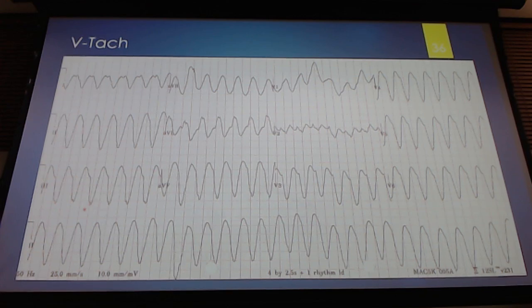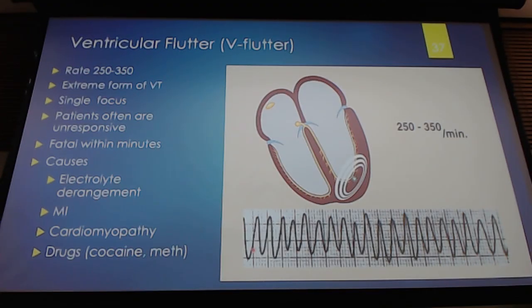But we're going to notice this wide complex tachycardia and say, okay, you're in VTAC, let's go ahead and do something about this VTAC. Let's slow you right down and get you back into hopefully a normal range. And so that's VTAC. These patients can come in certainly talking. They could walk into the clinic with VTAC, and then you do that ECG and you'll identify them.